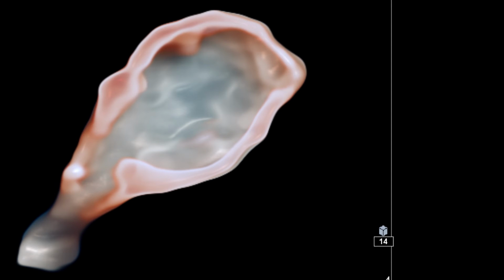That's all for today. I'm showing this tutorial on Philips Affiniti 50. Try to do it on your machine. The main technique is quite the same in every machine with HD 3D. I hope this basic will help you there. I have already recorded some more videos of this case in other planes. We'll try to post them later.